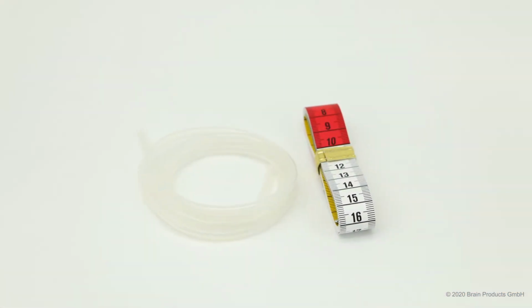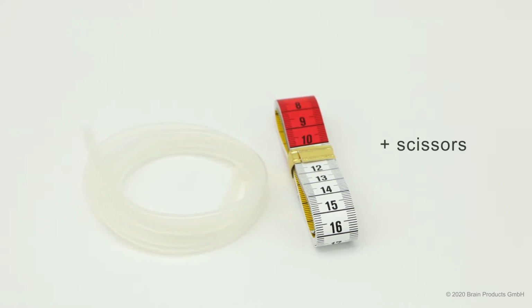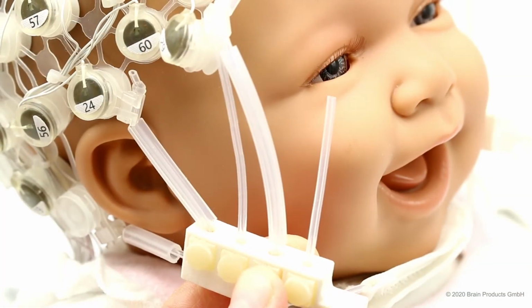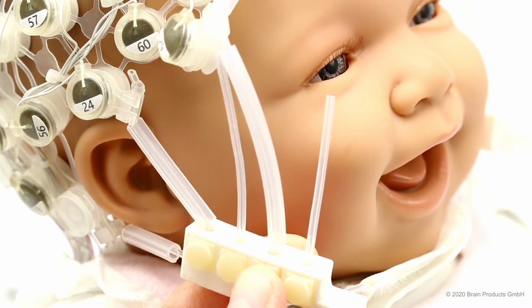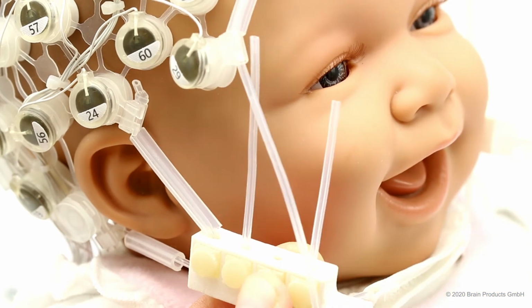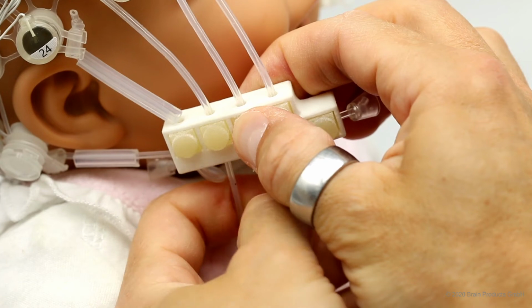To exchange a tube, you will need extra silicone tube, a measuring tape, scissors, and a pen. First, untie the knot. Next, press and hold the button on the clamping block that corresponds to the tube you want to replace. Pull out the silicone cord and remove the tube. Reinsert the cord and adjust the fit.